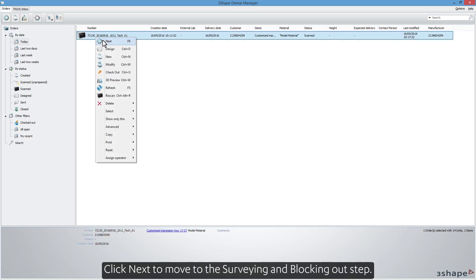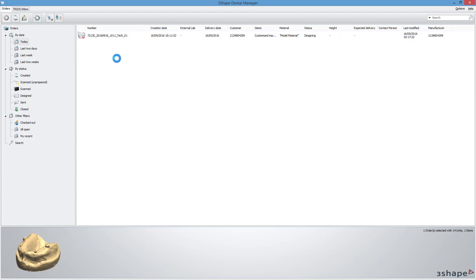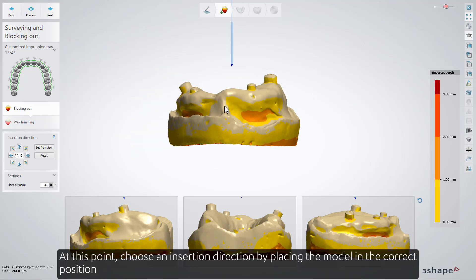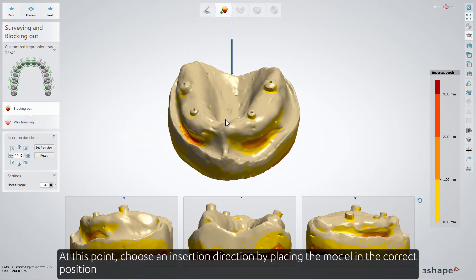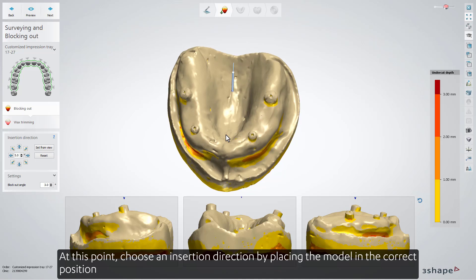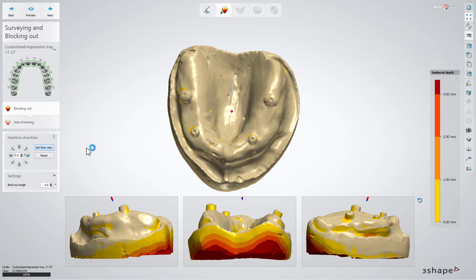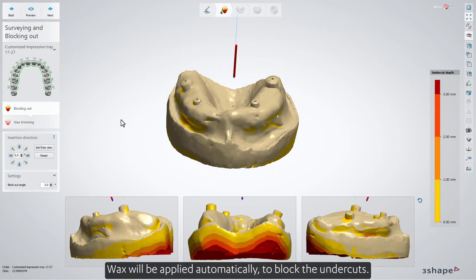Click Next to move to the Surveying and Blocking Out step. At this point, choose an insertion direction by placing the model in the correct position and click the Set from View button. Wax will be applied automatically to block the undercuts.